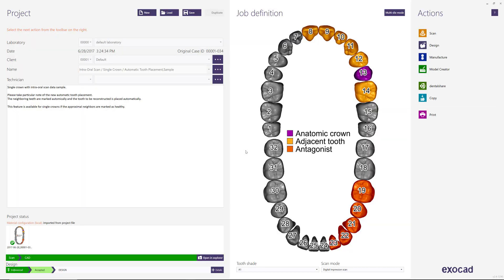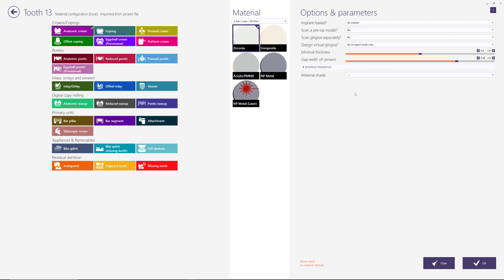What I'd like to show today is a question that's been asked quite a bit in the forums: how to change the parameters once you've designed a case. So let's take this Exocad demo case as an example. Say that we selected zirconia as the material, but once we're designing we decided that maybe we want to mill this out of a different material, say acrylic or PMMA.